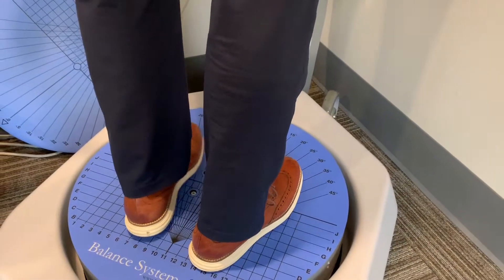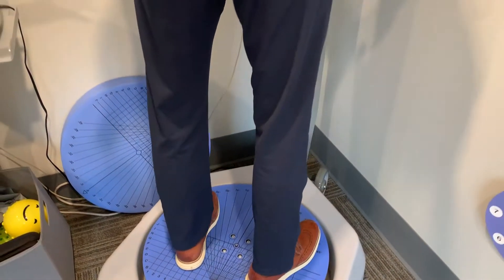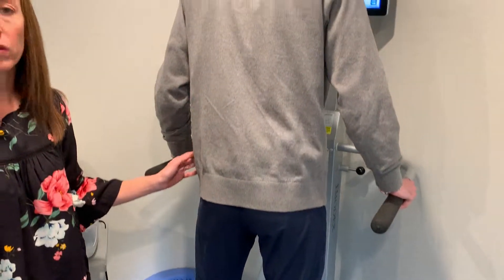Make sure your feet are about hip distance apart, and in the middle of that solid black line there — the horizontal line.